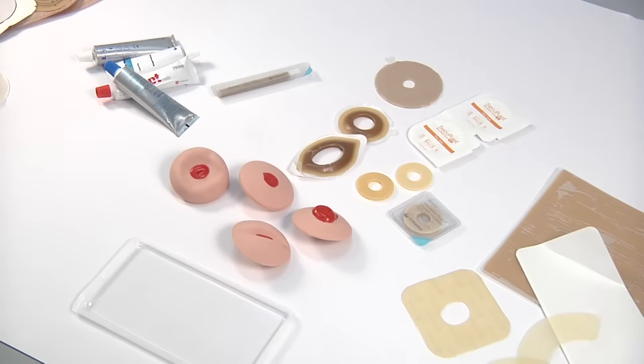We're going to review the commonly available barrier accessories, looking at individual merits and concerns. It's important to note that there's no universal language for describing or grading barrier accessories. Most descriptors come from clinician experience.